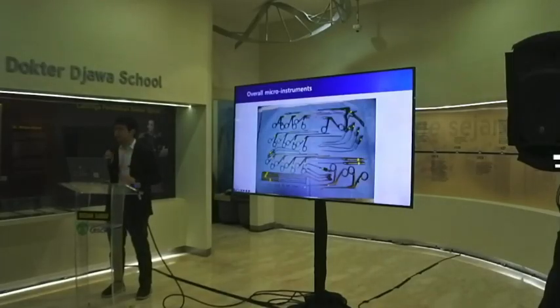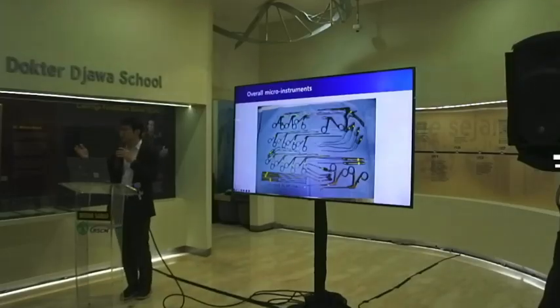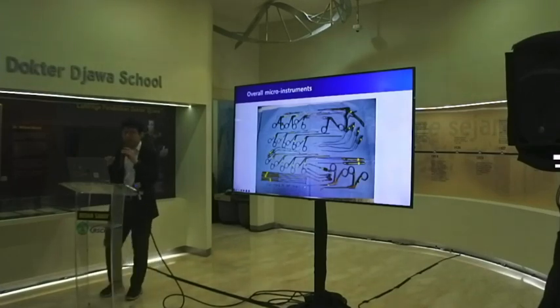Many neurosurgeons are not familiar with this kind of instrument, because ENT doctors may know endoscopic sinus surgical instruments very well, but neurosurgeons do not usually do the endoscopic approach. So getting familiar with this kind of micro instrument is the first step of this technique.